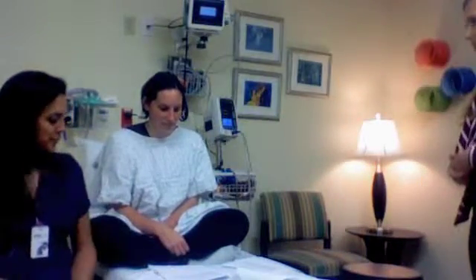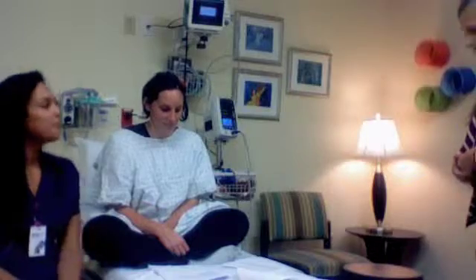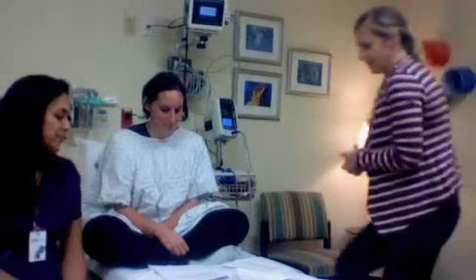Now I'm going to show Cece the correct way to take a blood pressure on a pediatric patient. Alright, first I'm going to sit down. It's important to talk eye level with these children. It just creates a more non-threatening environment. It makes me as tall as you, essentially.